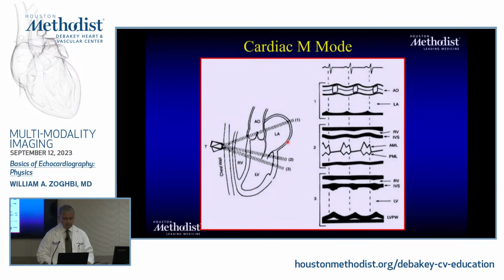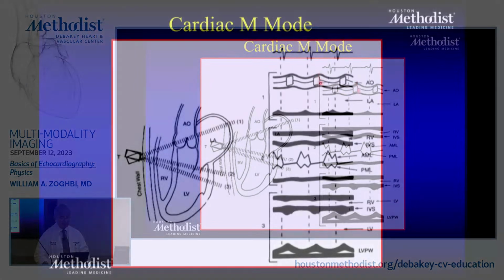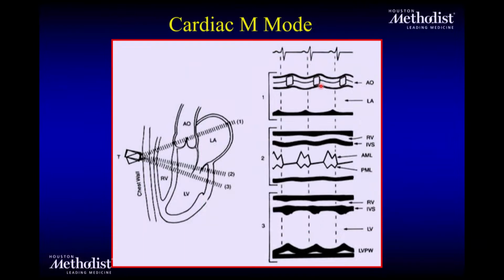So in real life, an M mode would look like this, and I know most of you are familiar with it one way or another. If I take a look at an M mode of an aortic valve, it opens and then closes. If it closes and there's some motion on it, it's still a dot. Then when it opens, it almost looks like a box.